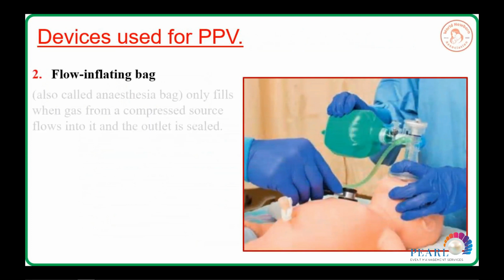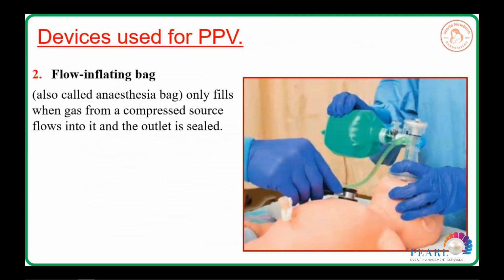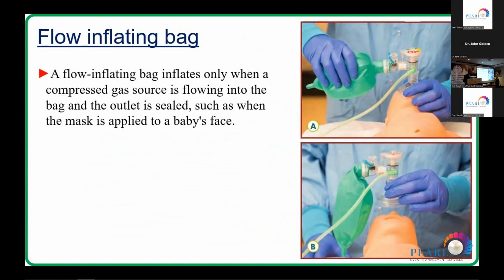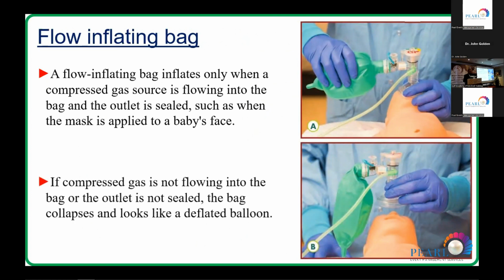The second one, the flow-inflating bag, also called the anesthesia bag, only fills when gas from a compressed source flows into it and the outlet is sealed, such as when the mask is applied to the baby's face. If the compressed gas is not flowing into the bag, or the outlet is not sealed, the bag collapses like a deflated balloon.